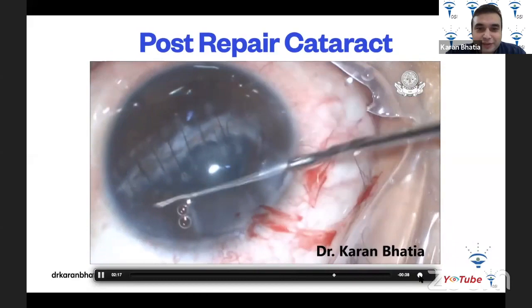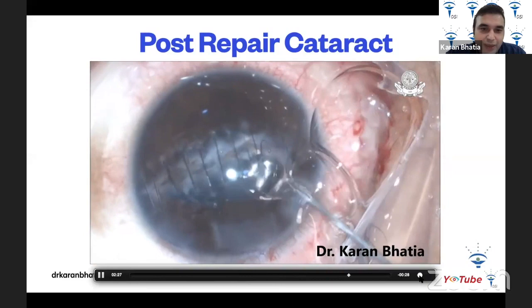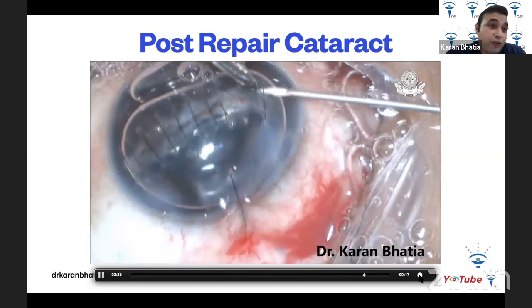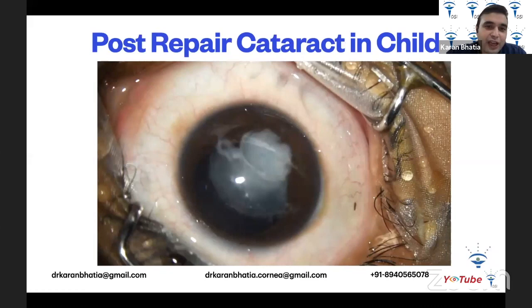This video is from 2016. After removing all the viscoelastic from the anterior chamber, some air is injected. The main incision is sutured and loose sutures are removed. Sutures should ideally be removed at three months, but loose sutures must always be removed promptly as they can result in a suture infiltrate. The patient did very well.